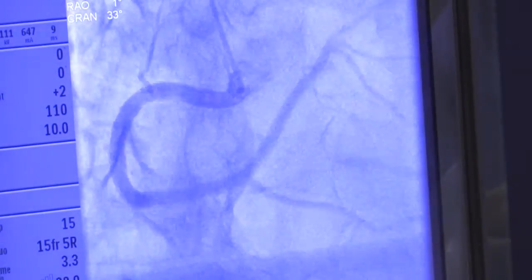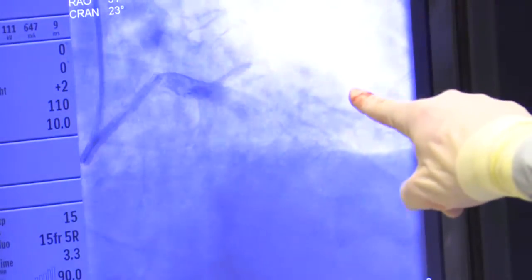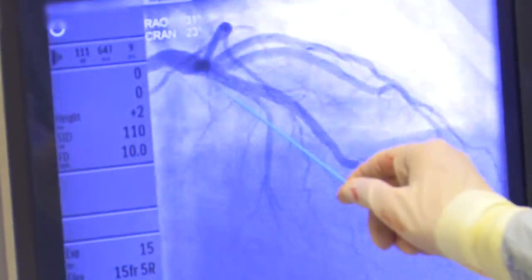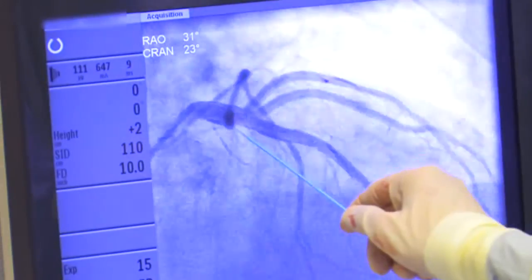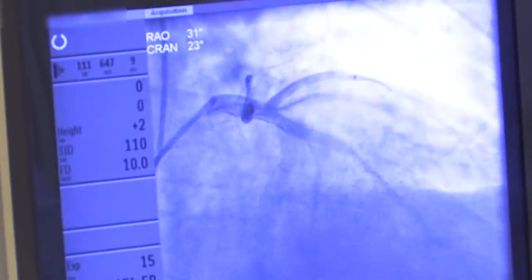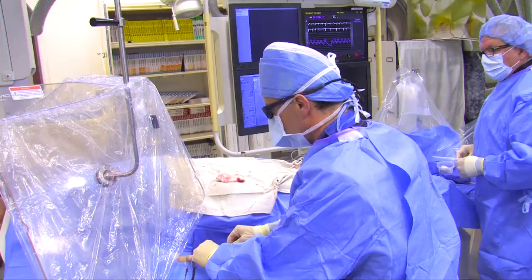This again is the right coronary artery — we're just reviewing all our images. In the left main, which is the most proximal trunk, there's a little mountain inside of there — we're going to call it a 30% blockage. That 30% blockage in the left main artery is not going to be significant; it's not severe enough to fix with an angioplasty. But we will aggressively control his cholesterol. The other arteries all look fine, so we're going to remove the catheter.